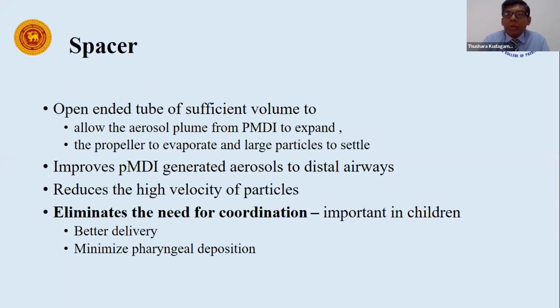As I said, it can be better to use it with a spacer, and we all know a spacer is an open-ended tube which allows the aerosol to expand and the propellant to evaporate. Also the large particles will not travel to the distal airways. As you know, the smallest size particles, 5 microns, will travel towards your distal airways.